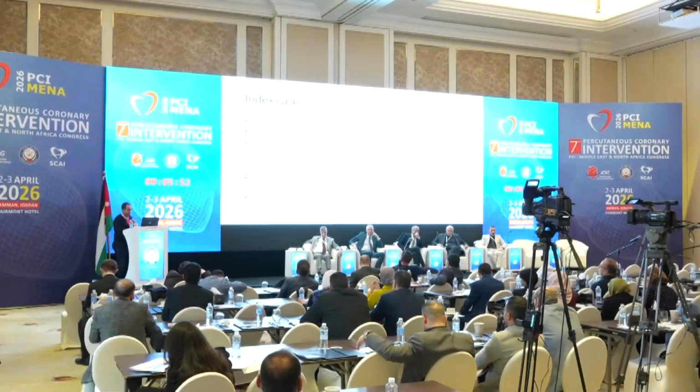Now, the other thing, for Dr. Raed, it's a beautiful case which you put up. But going back to the basics of intervention, you cannot diagnose a calcified nodule by angiogram, period. You just can't. Nobody can do it. So putting up an angiogram and saying this is a calcium nodule, I'm not quite sure. You need an IVUS or an OCT to say it's a nodule.